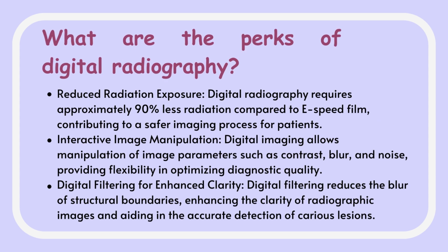So, what are the perks of digital radiography? Reduced radiation exposure. Digital radiography requires approximately 90% less radiation compared to E-speed film, contributing to a safer imaging process for patients. Interactive image manipulation.